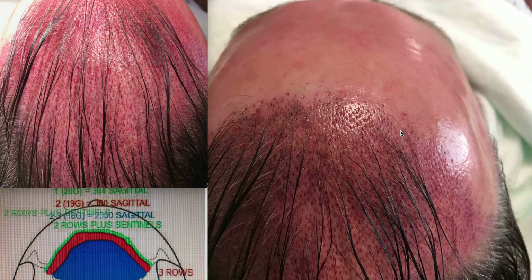It'll be a divergence pattern, which is exactly what I see when I teach my students in St. Louis, and it just doesn't look right. So if you take a look here, these hairs almost go this direction. So you want to slowly blend going this direction. So that convergence pattern this way leads in the lateral few centimeters toward a little bit of angulation that matches the frontal temporal angles, and that's very, very important.